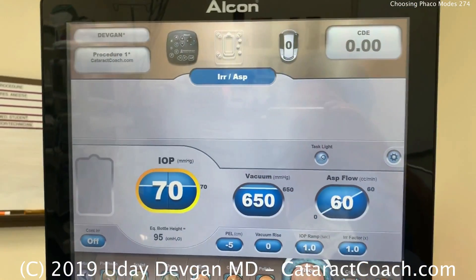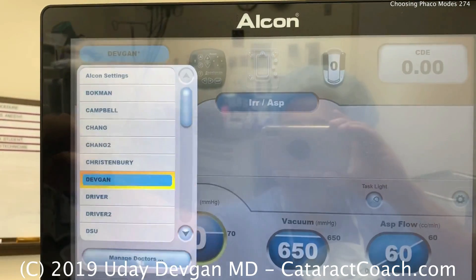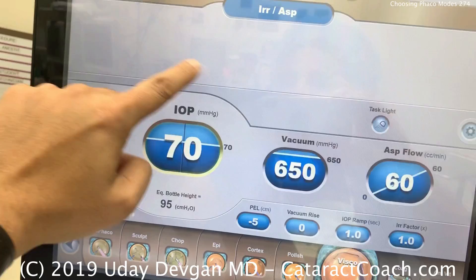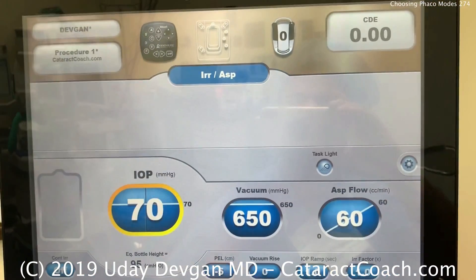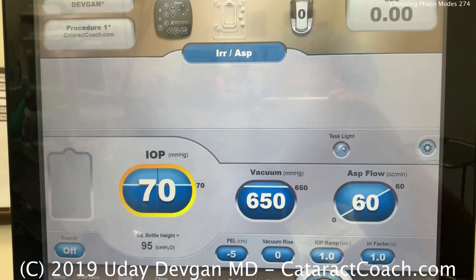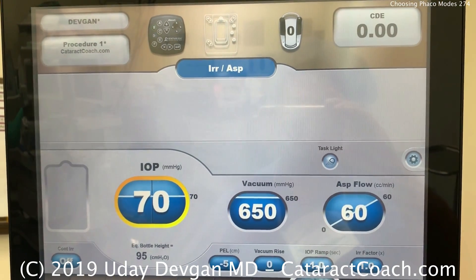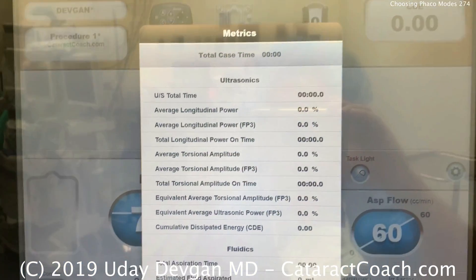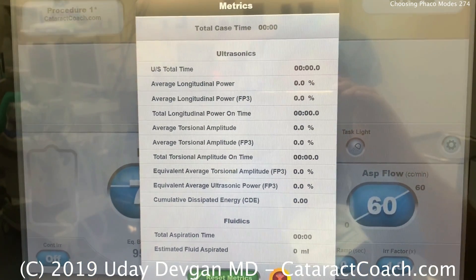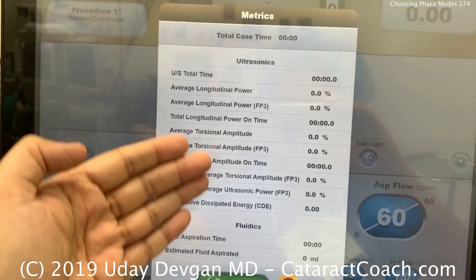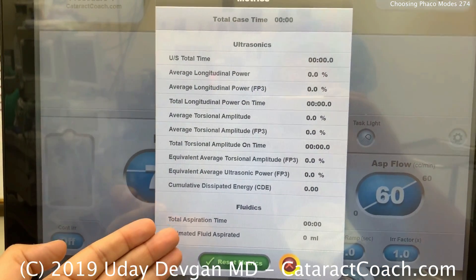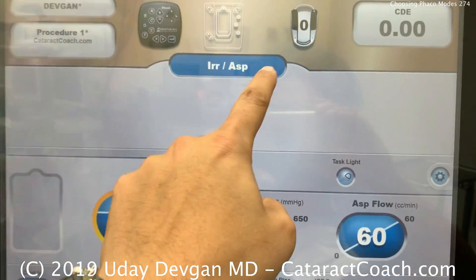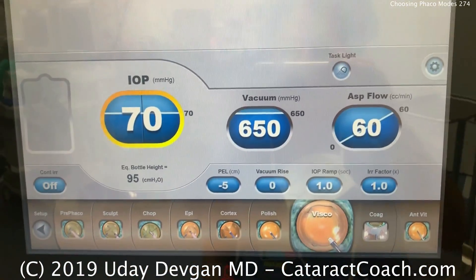Let's look at what else we have on the screen. We have the surgeon name in the corner, and we can choose from a number of other doctors. We have different procedures, so you can choose settings based on different types of cataracts or different surgical techniques. In the corner, that's the amount of energy placed in the eye. At the end of the case, this will keep track of how much ultrasound power was put in the eye, how much fluid went through the eye, and the timing of the case. This is also telling me our current mode.